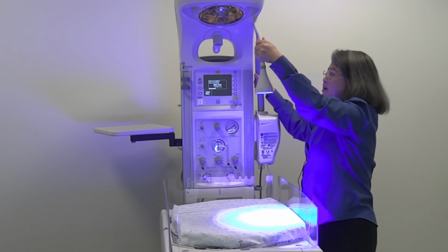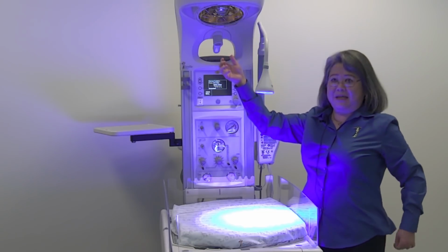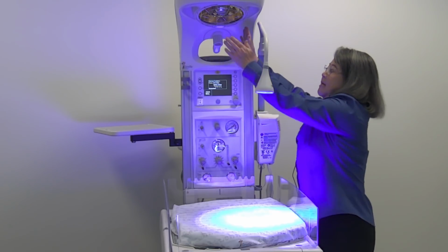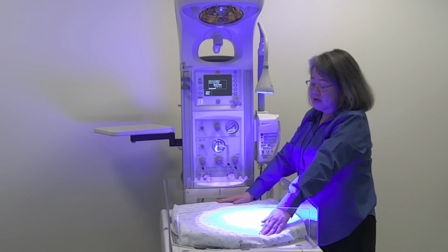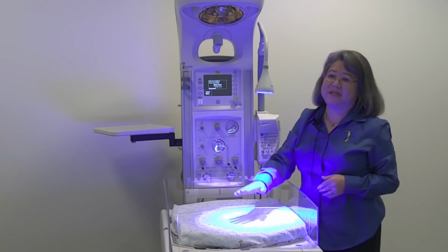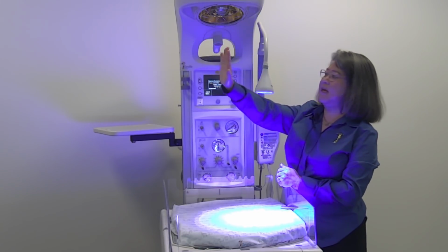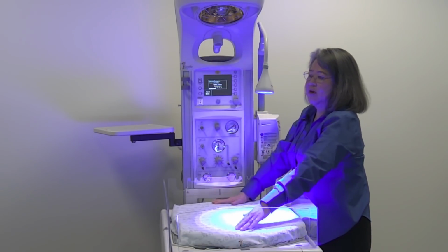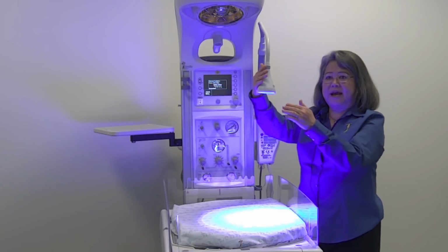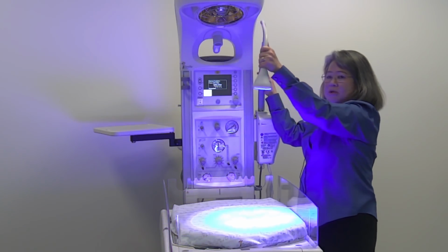The other point I want to make sure I talk about is this heater delivers a lot of heat, and the heat pattern comes to a middle here and is directed on the back to the mattress. You do not want to be in the path of this heat. So if you could imagine, this is the midline of the heater, and this is where the heat comes to a cone and comes down here. From where you are, you can see I'm not in the middle. I'm more to the side.